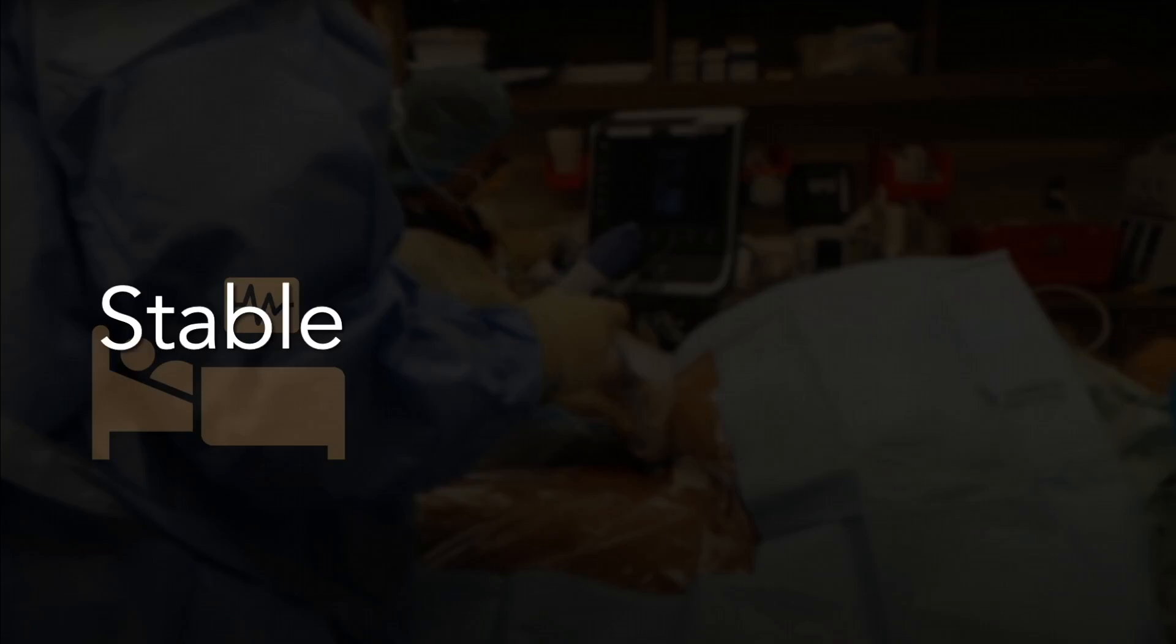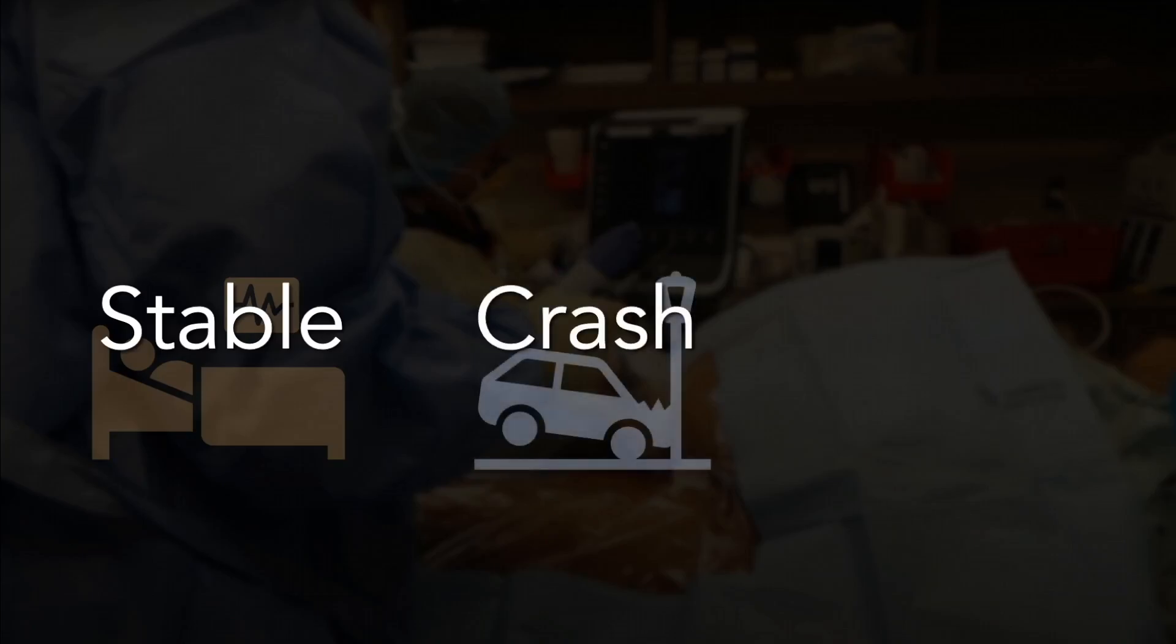First, we'll talk about placing a femline in your stable or stable-ish patient where you have a few minutes to gown up, get sterile, and do it right. But is this an okay line to place? Isn't this a dirty line? After that, we're going to talk about the infamous crash femline when you are in a code situation and someone inevitably yells for the central line kit and then just starts stabbing the groin. Do you need to do this? And then last, we're going to talk about a couple of tips if you do decide that a femline is the right line for your patient.